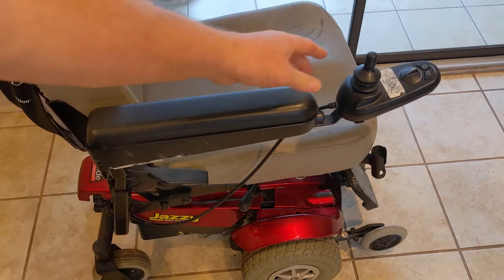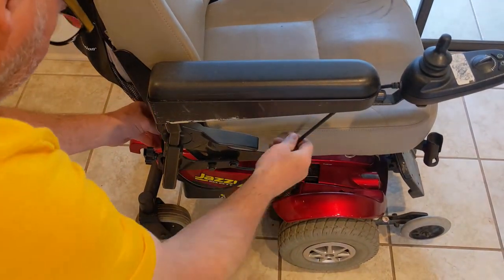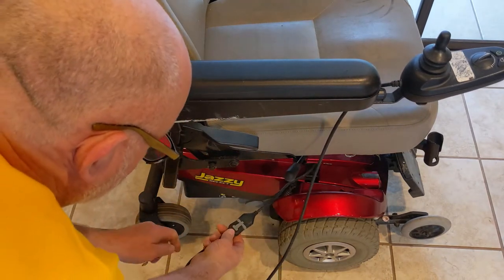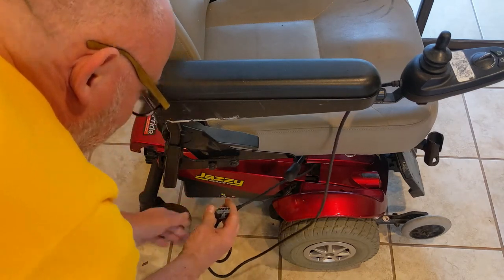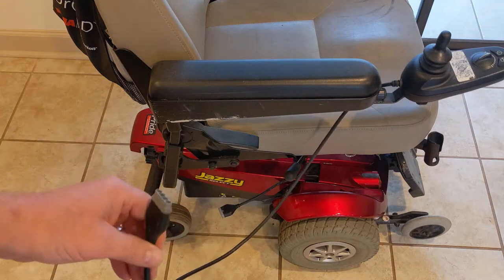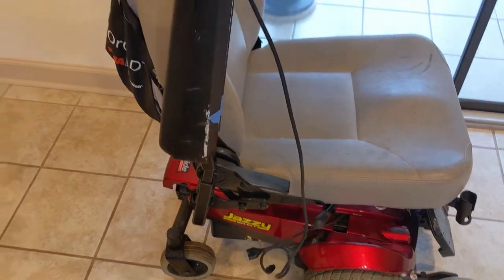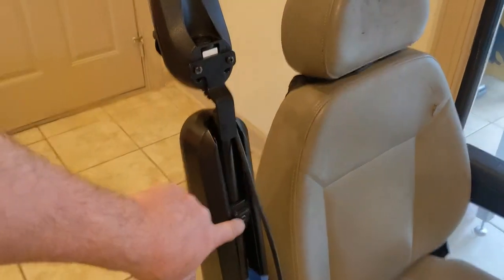To disconnect the controller, you follow the cable along and it goes down to the main controller. It has a little release — you push that little tab and pull it — and there's a four-pin connector that disconnects.